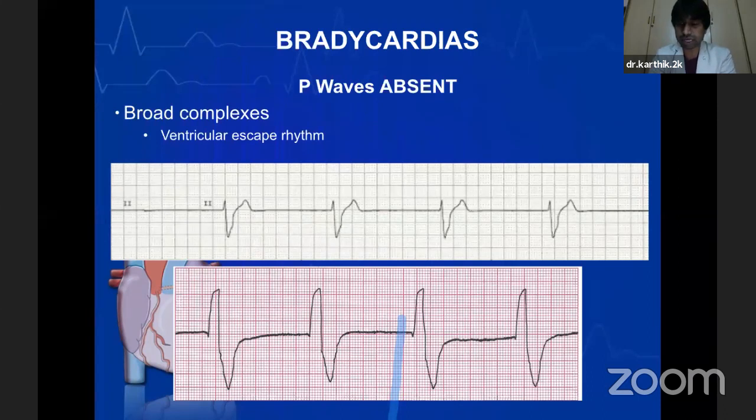This is of very important clinical importance, because in casualty or an emergency, if you come across such arrhythmias, it should not take too much time to diagnose them. So this 7-step approach will help you diagnose the entity initially and act accordingly. Then you can see what the other causes are.